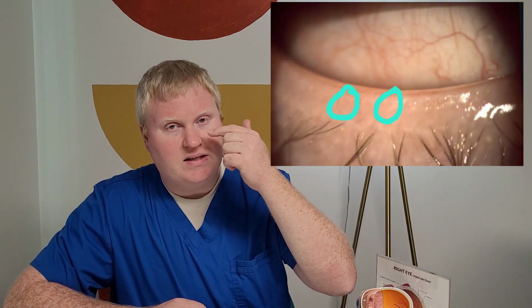So, the Maskin procedure. This is a procedure that I think most patients get a little bit nervous about because we are working on opening the top of the oil gland. The oil glands are in our eyelids, and the openings to those oil glands are right behind our eyelashes. And they're very, very small. I do this procedure under 10 times magnification because otherwise the oil glands are just too small to see.